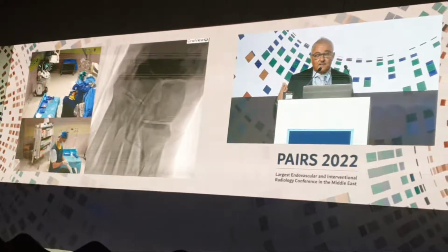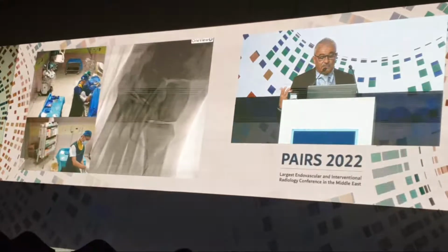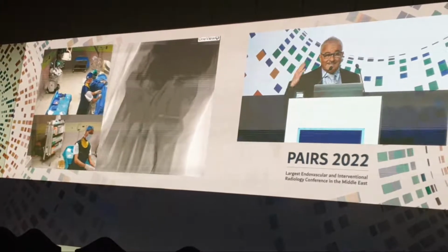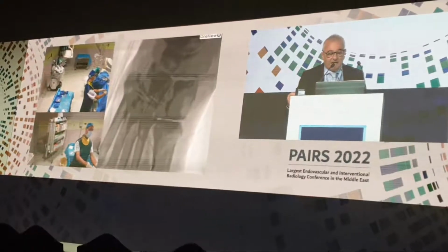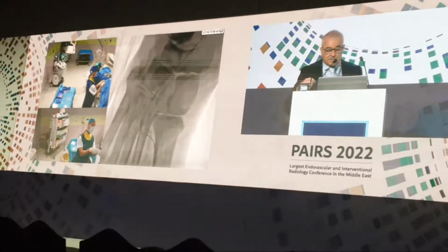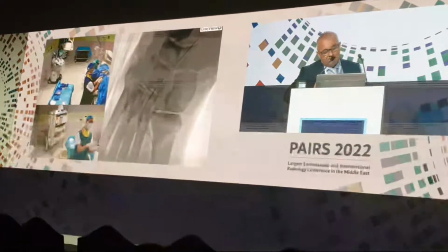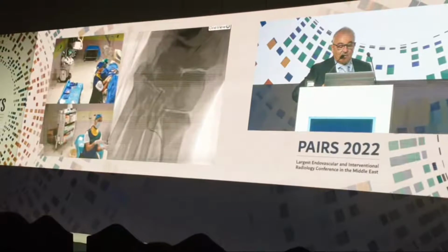This is the digital or metatarsal artery of the first toe from the posterior circulation, on the plantar side of the foot. You can see how calcified the corresponding anterior digital arteries are, from the anterior circulation on the dorsal side of the foot.